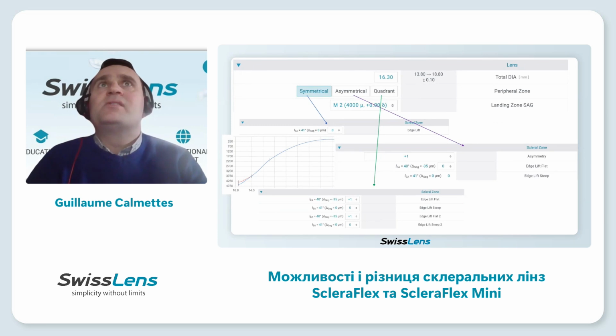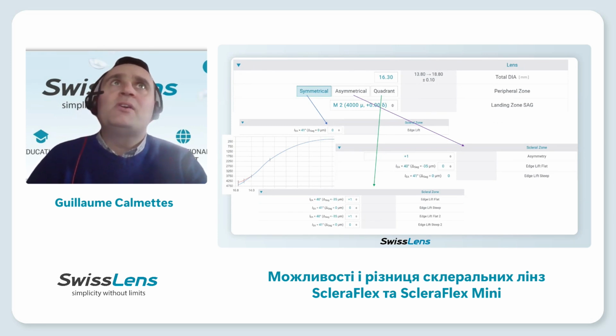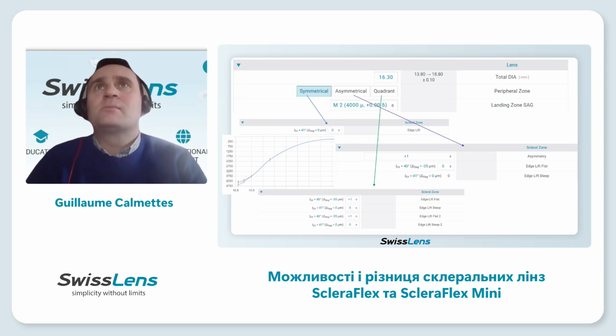Edge lift, what is different between a symmetrical scleral lens, an asymmetrical scleral lens, or a quadrant specific scleral lens. So you can see, with symmetrical, on the scleral zone, you have only edge lifts. So that means when you change something, it's changing for all around the lens.